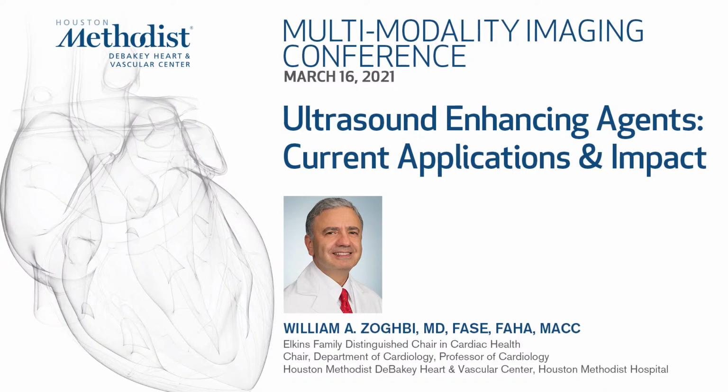Today we're going to talk about ultrasound enhancing agents. We used to call that contrast echocardiography, but I think it's much more appropriate to think about them as ultrasound enhancing agents because their application is not only for echocardiography, but for multiple other uses that we can talk briefly about. And so these guidelines or clinical applications of such have been updated, and we'll share that with you.